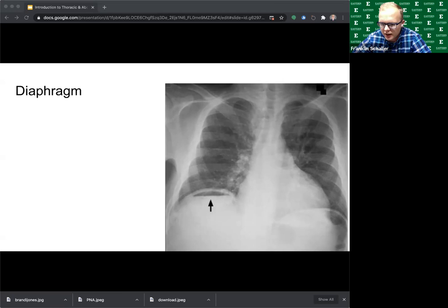Is everybody seeing that pneumoperitoneum there on the right hemidiaphragm? It almost looks like a little sunset of dark space or air. You guys see that there? It's subtle, but that's an emergency. We have to pick that up every time.